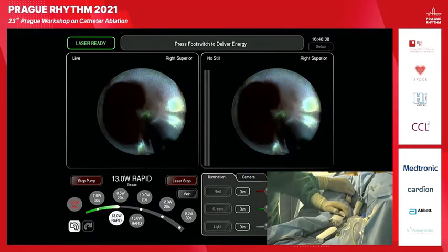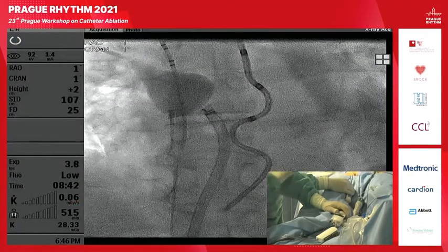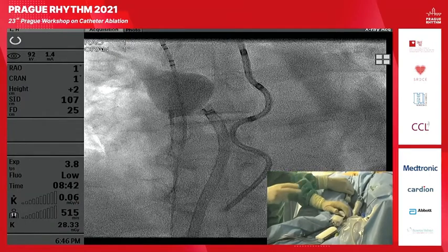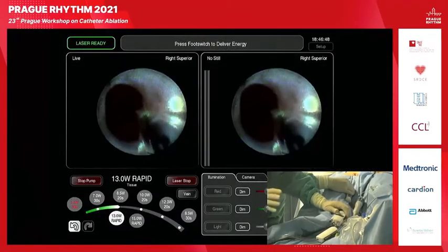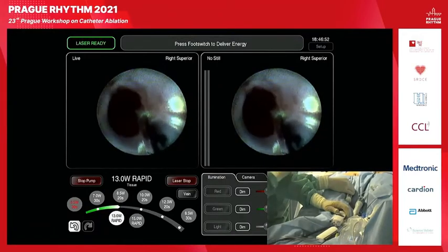So I will start, guys, so you will see. Before I start, I will explain. For the rapid mode, we have two options, 13 watts and 15 watts, which is the so-called equivalent of the other manual dosing.